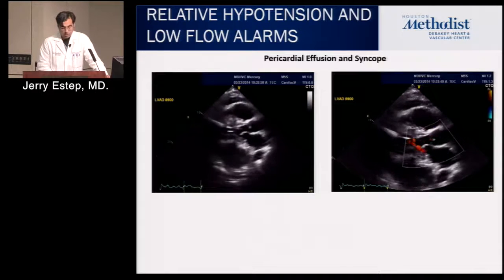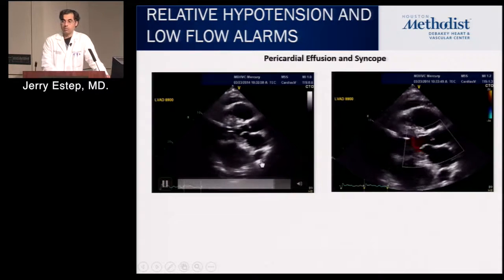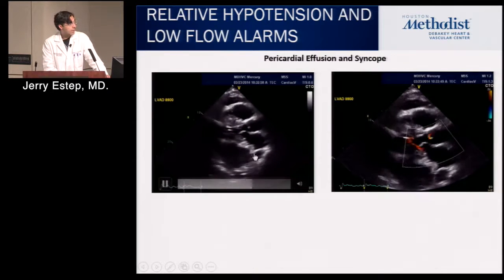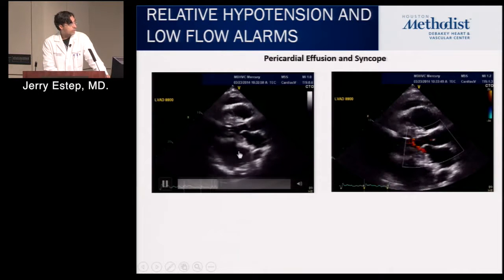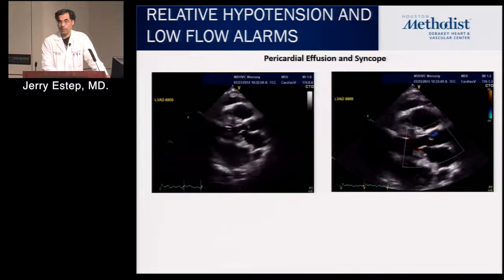Now, this is someone in the ICU with low blood pressure, high CVP. So you want to make sure it's not significant RV failure. And tamponade can be a little bit more challenging because these patients are on a continuous flow LVAD. But when we see pericardial effusion, certainly in the presence of chamber collapse, we drain it. If we see significant pericardial effusion with hypotension and we don't think it's RV failure, we drain it. We take it out of the equation.